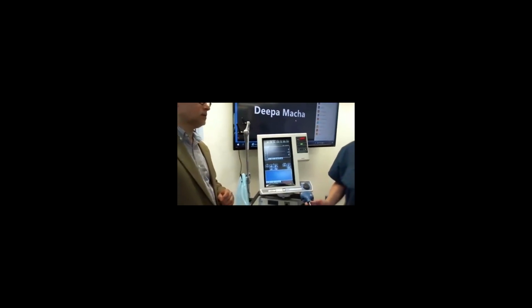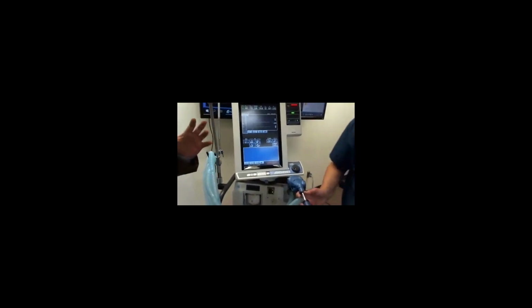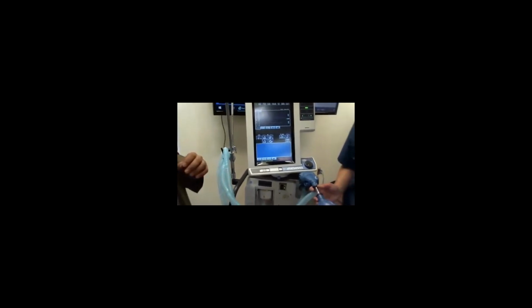Any other questions? Do we have to adjust the inspiratory expiratory ratio? The respiratory therapist will adjust that when the lung becomes stiff, then we'll discuss changing the ratio. So the initial will be 1:3 or 1:2 at least when we start.